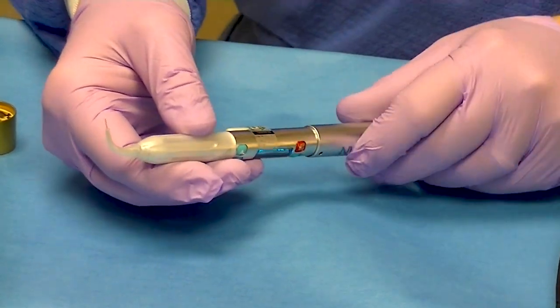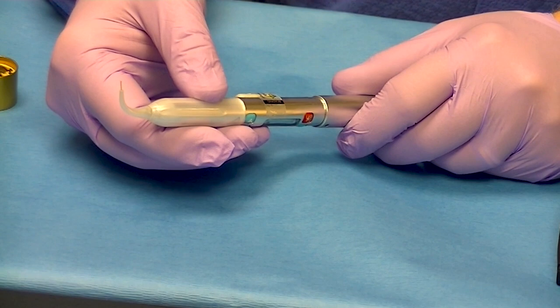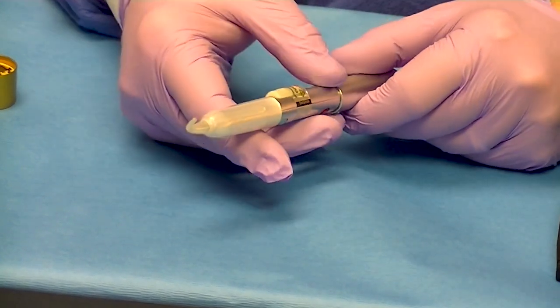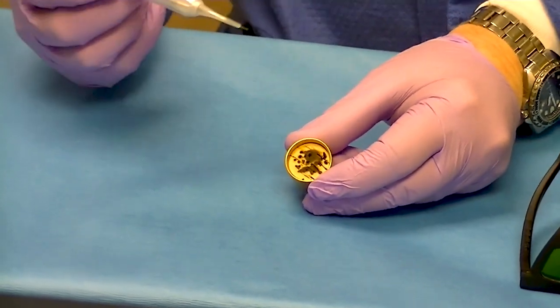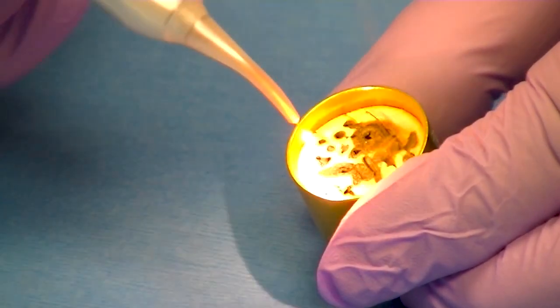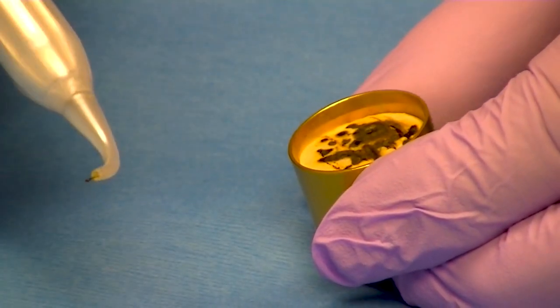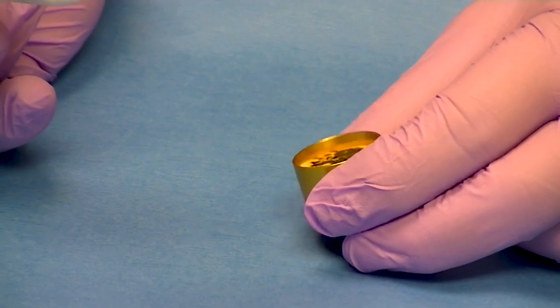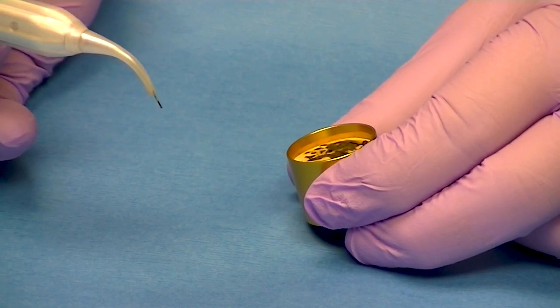For procedures like a gingivectomy, laser troughing, implant recovery, removing hyperplastic tissue, a biopsy, or cuspid exposure, we're going to want to initiate the tip. We have a cork, and with your protective eyewear on, we simply initiate into the cork — all that's doing is charring the tip, which allows for cutting. We don't initiate the tip when we're doing laser bacterial reduction, or if we have a herpetic lesion or an aphthous ulcer, where we're not cutting anything.